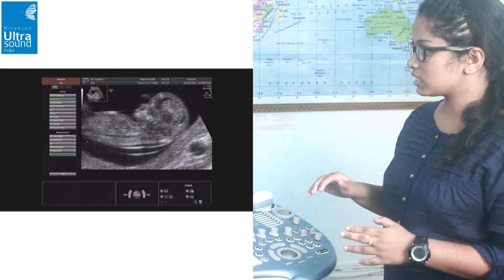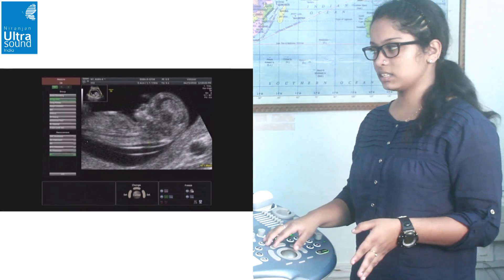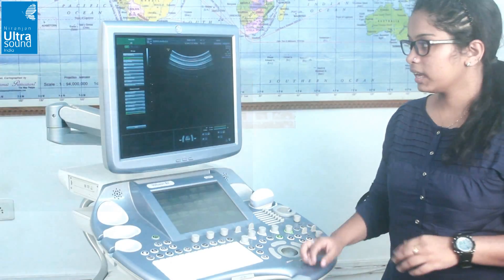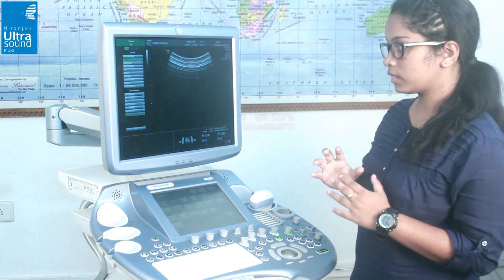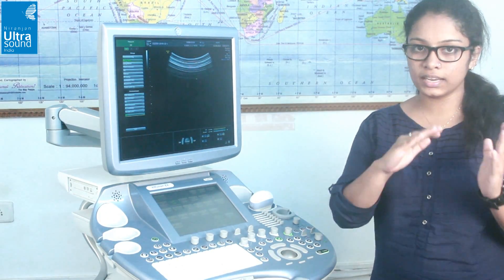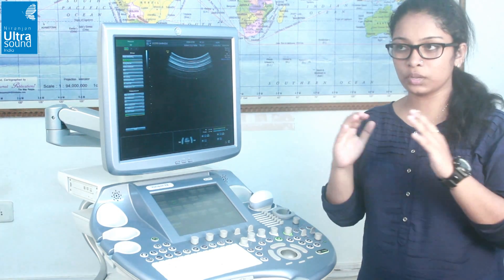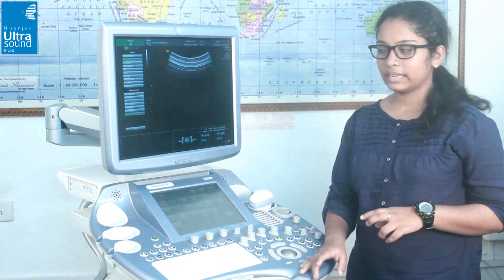Then we go into the second measurement, that is Sono NT measurement. Again we can choose two methods of measuring: the first one is inner to inner, and the second one is inner to the middle of the membrane.